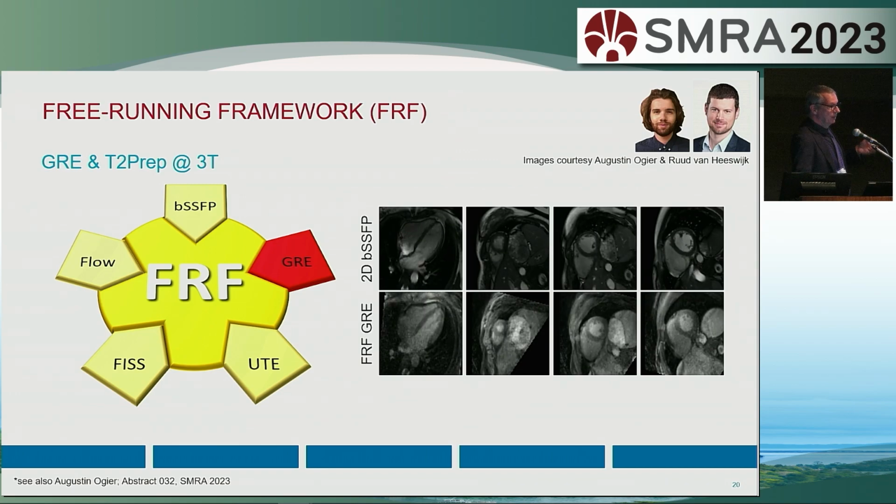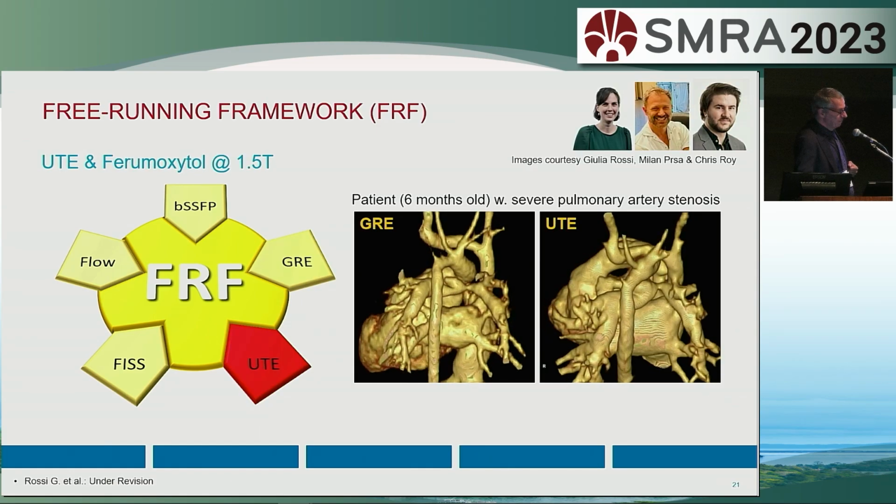You also have to think about that these sequences are non-selective, so you don't have an inflow contrast whatsoever, so other means of generating contrast are required. And this was about 6-minute scans.